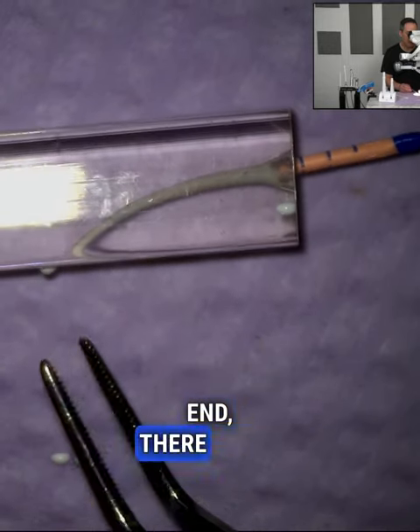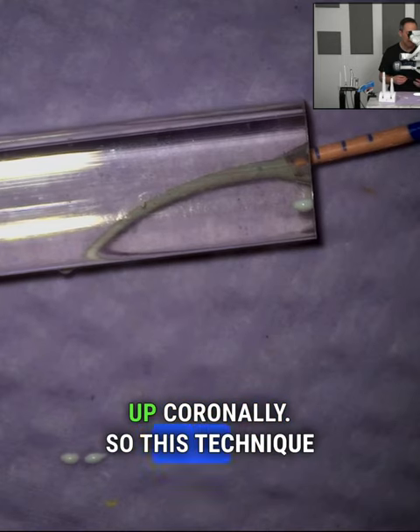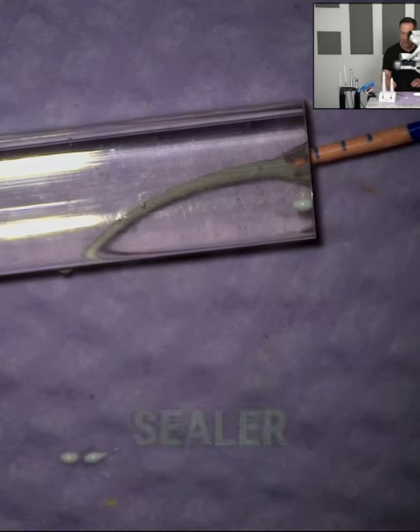At the coronal end, there was a little eking of the sealer up coronally. So this technique is effective and powerful for BC sealer and obturation.